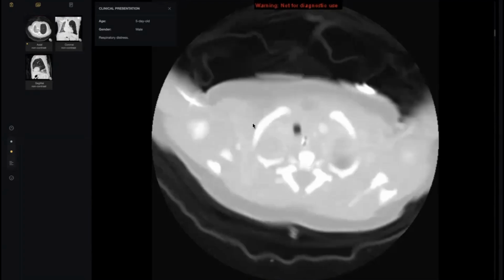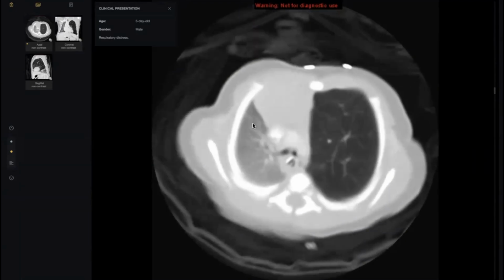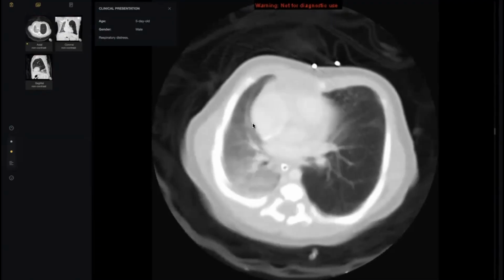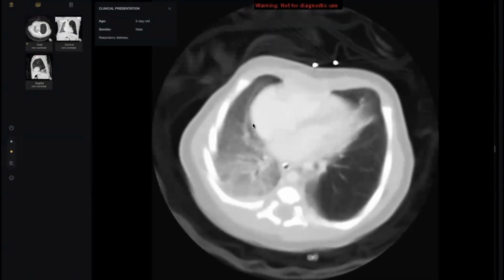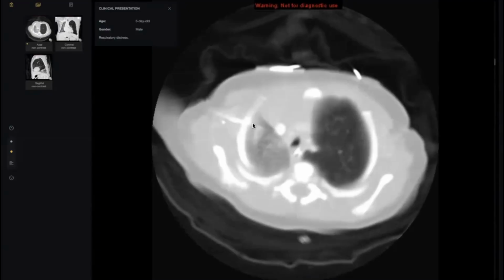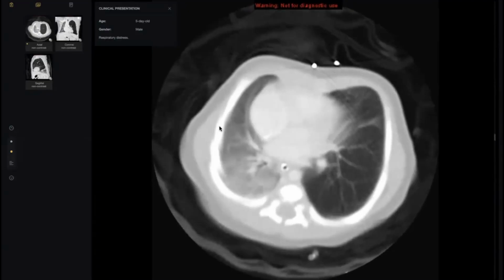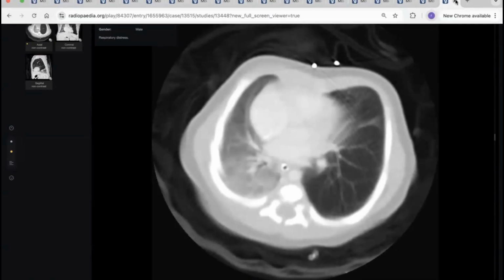So when you are looking at an axial, ask yourself what you want from this sequence. In this case exactly, you want to rule out a foreign body from the beginning. Okay, my colleagues? Thank you, doctor, so much.